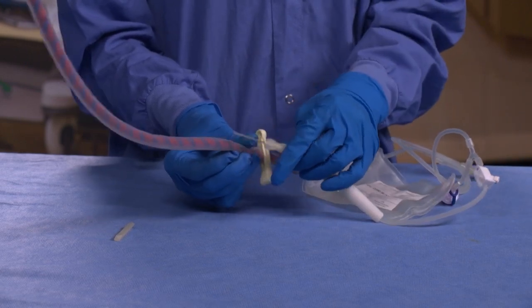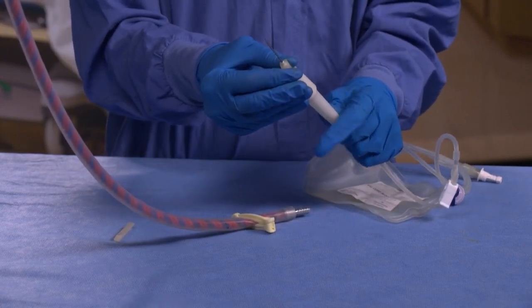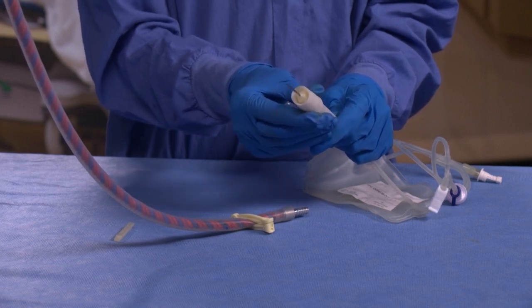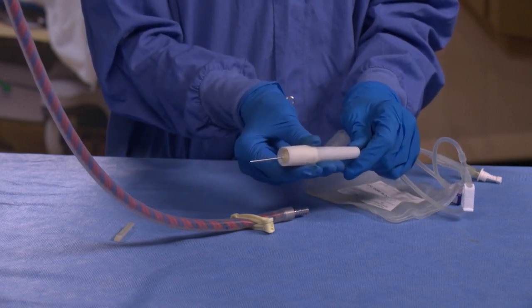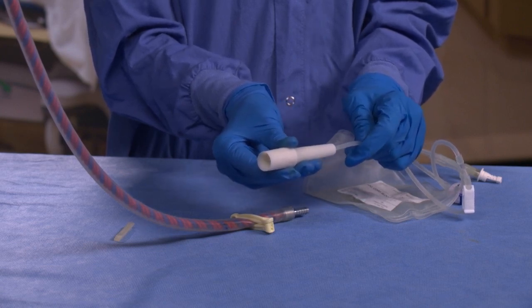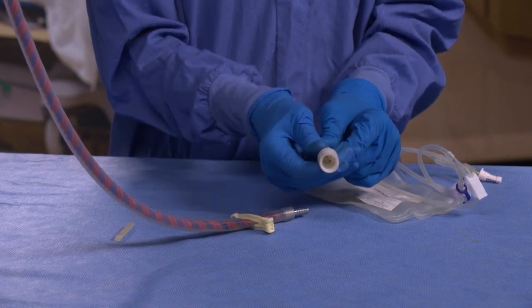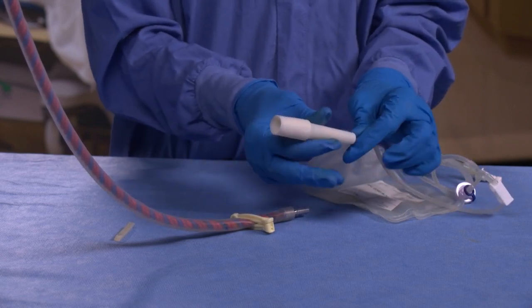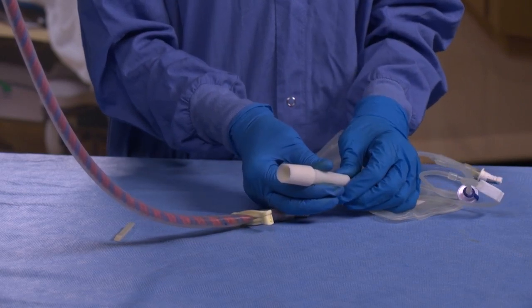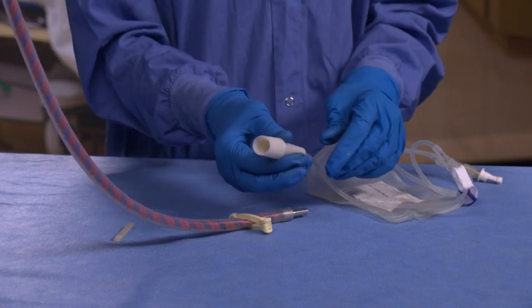Once the blood has stopped flowing, close the white clamp while the needle is still in the vein and remove the needle. Slide the donor care needle guard halfway over the needle hub. Hold both sides of the donor care needle guard near the front with one hand, then hold the tube while pulling smoothly. Pull the needle into the donor care needle guard until it locks into place. Double check the needle is locked by listening for a second click as the needle goes into the donor care needle guard. Check to make sure the tube cannot be pulled through the needle guard.